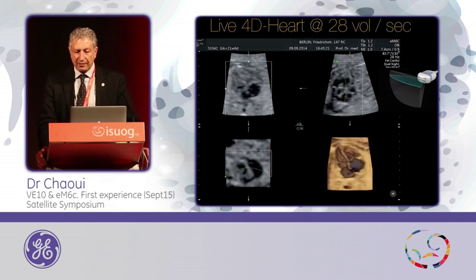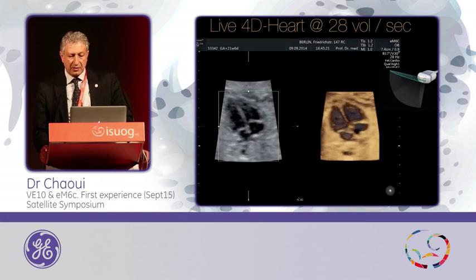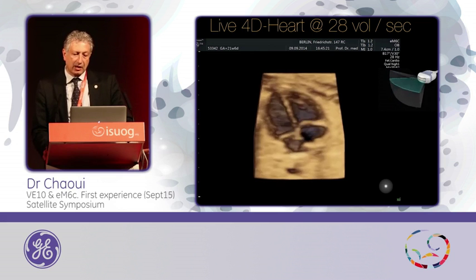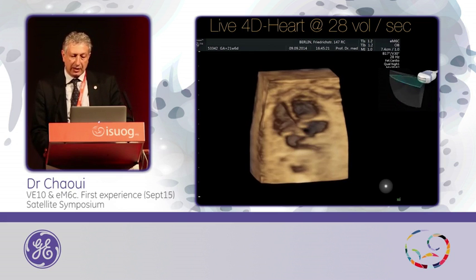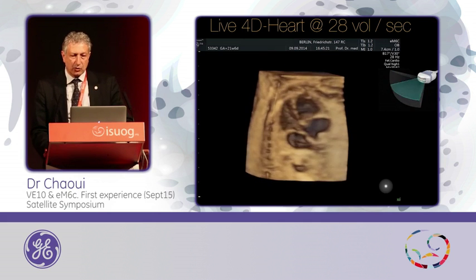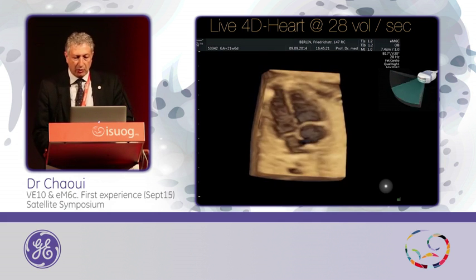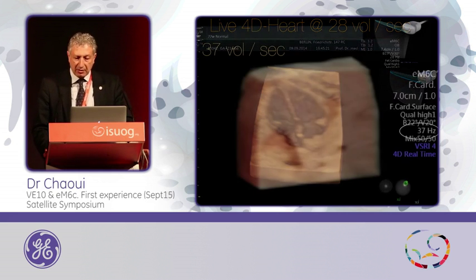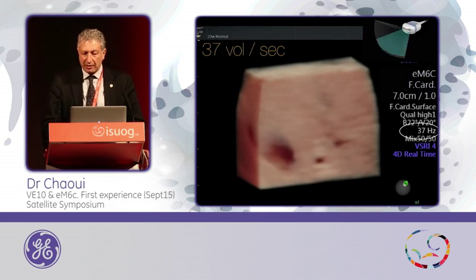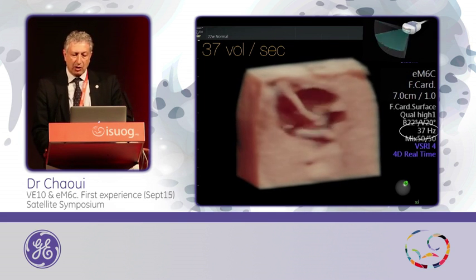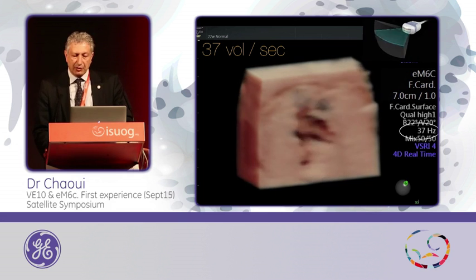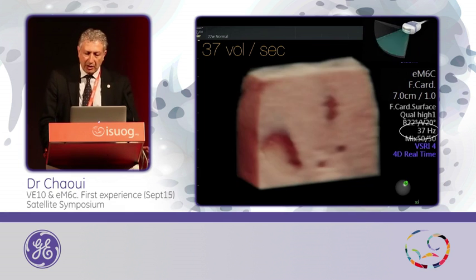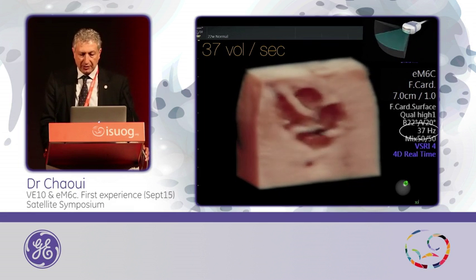You can do it in live mode and examine the fetus. You can add the surface display and look inside the heart, and move the volume to look in and out. You can cut as you want because you have rapid image calculation. Here is a volume running at 37 images per second where you can scroll from the upper abdomen and move the transducer to get to the great vessels. This is today feasible, and we can rely on a live probe to look at the heart.